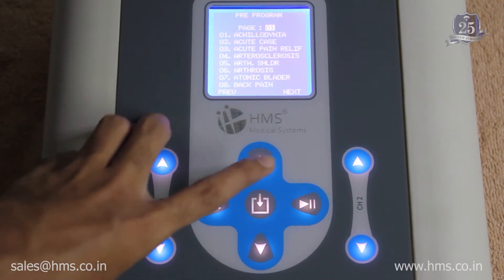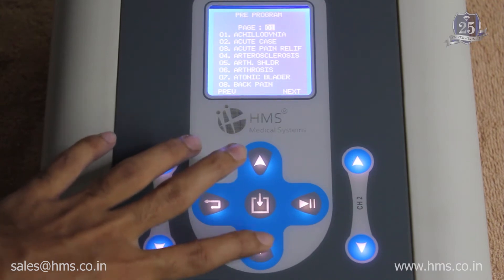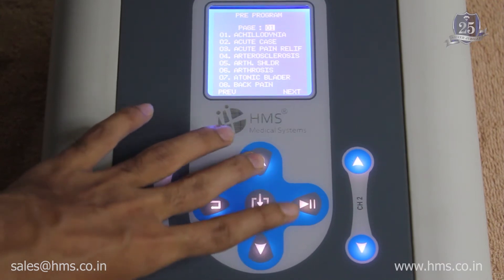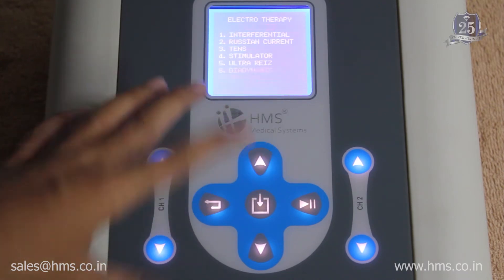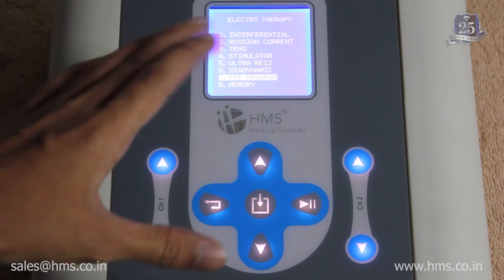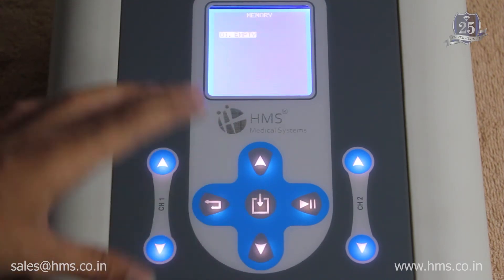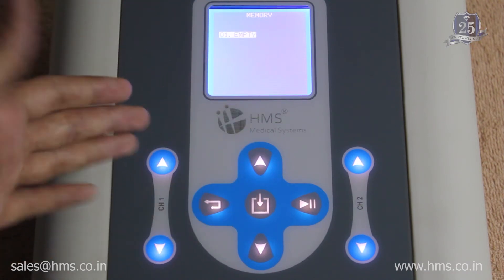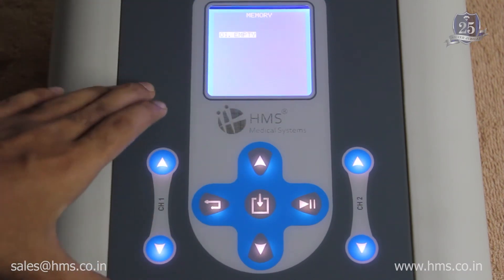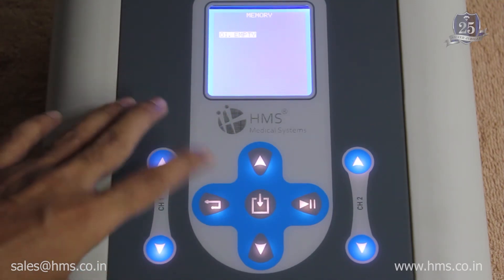There are a total of 77 pre-programs available with the machine, and you can choose according to your needs. Additionally, there are 30 memory settings where you can store your own configurations. All 30 memory settings are re-writable, which makes it very useful.